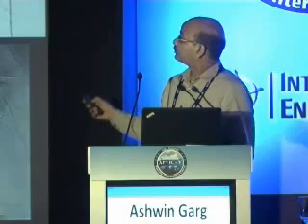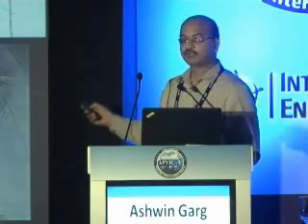So the patient was referred to the cath lab, where we did the angiography, and the conventional angiography revealed multiple filling defects in the profunda femoral artery, and the superficial femoral artery also showed multiple intraluminal filling defects. The popliteal artery showed multiple defects, and there was partial reformation of the anterior tibial artery. So in order to decrease the load of clots, I thought I should do the mechanical thrombectomy.